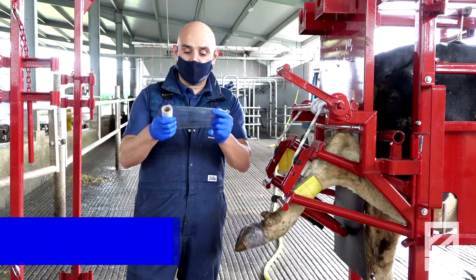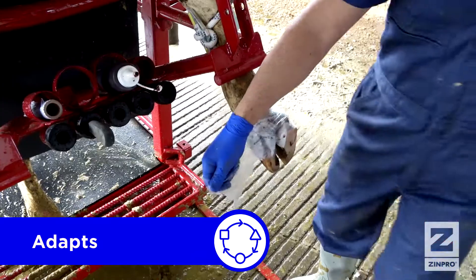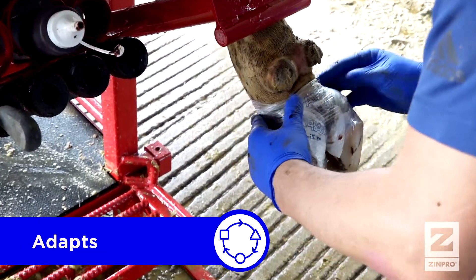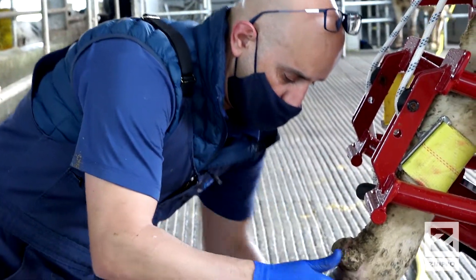The wrap has a certain capacity to absorb water, allowing adaptation to the environment. In dry environments it will last longer, and in very moist environments where we do not want the bandage to stay for long, it will dissolve faster.